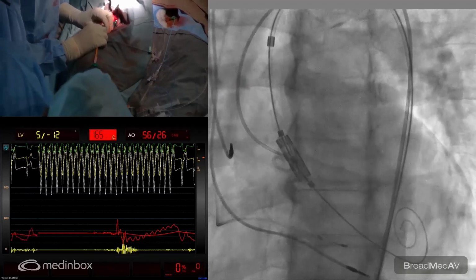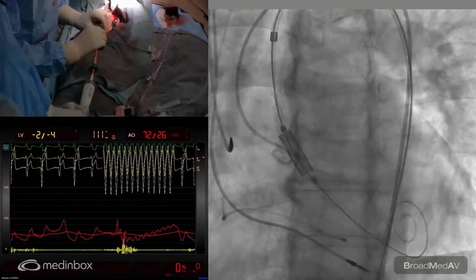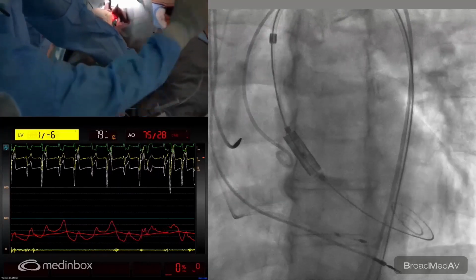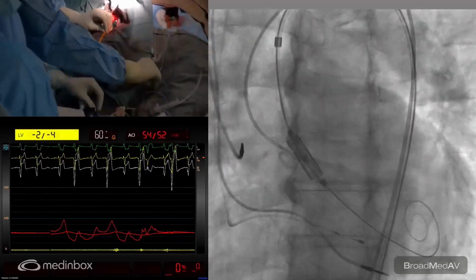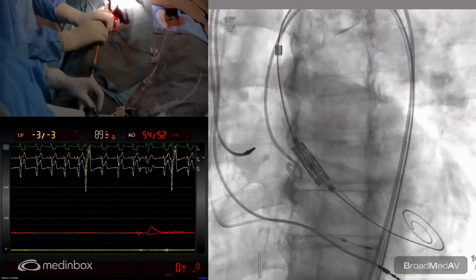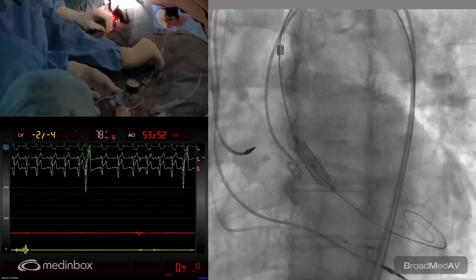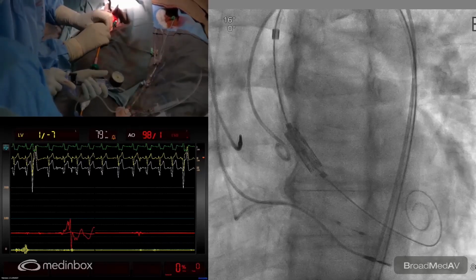Okay. Yeah, okay. That's good. Small checks there again. Just rotate. Don't do anything. Yeah. Take a shot. Finish shot. All right. Yes, it looks okay. So we'll go back on the pressure here now.